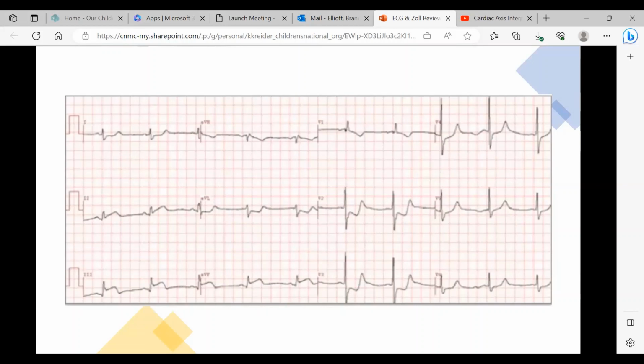Okay. So what part of the heart, if you were to label it, do you think is being involved? That's a good question. Where's that chart? The chart is on the PDF, so you want the chart? All leads. What's inferior? Am I right? So inferior, yes. I take my little lead out, draw my little heart. I'm looking at my diagram here real quick. Look at your diagram.